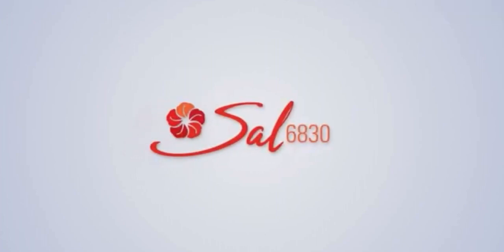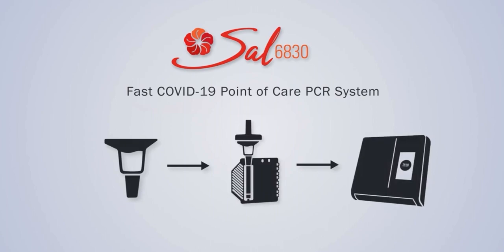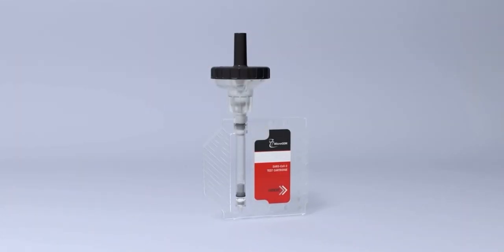MicroGem's Sal 6830 SARS-CoV-2 saliva test is a fast and non-invasive COVID-19 PCR test that accurately delivers results in under 30 minutes at the time and place where the test is given at the point of need. Here's how it works.